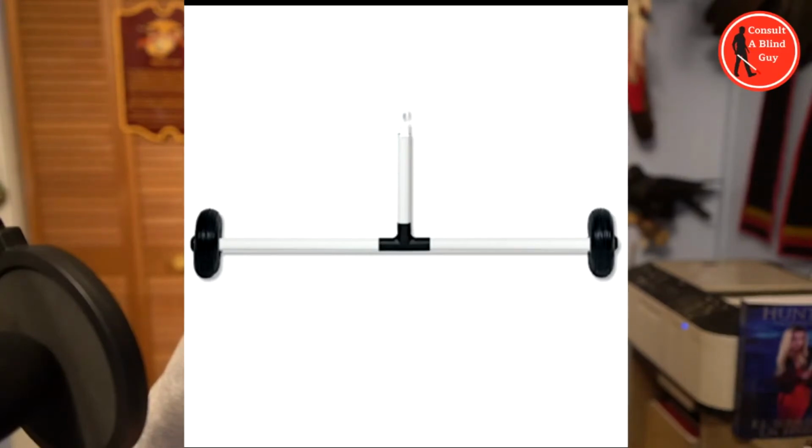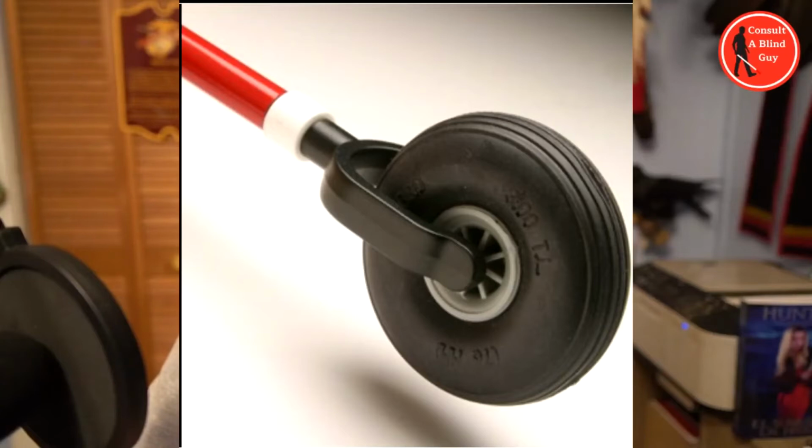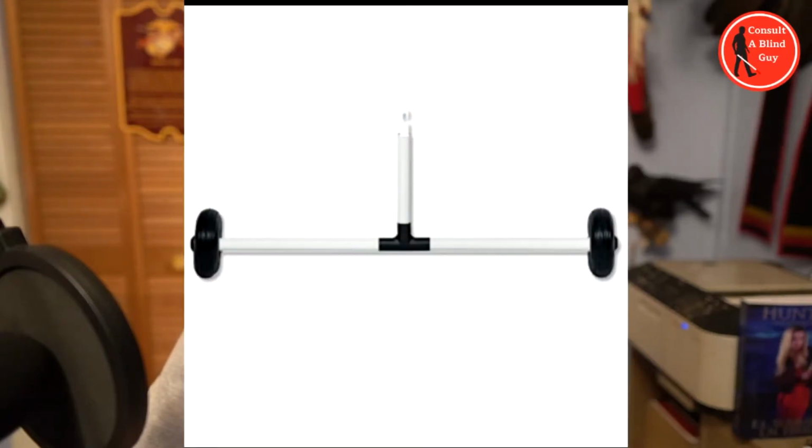push broom tip. These are a little bit more expensive than all the tips that I've shown before, and the Rover Freewheel is a single wheel, as you can see here, and it has a hook style attachment just like the rest. Same with the push broom style, which has two wheels, and I can see these being used by the multi-disabled, for those who are visually impaired and the physically disabled, like somebody who has a very hard time with rotating a wrist and things like that.